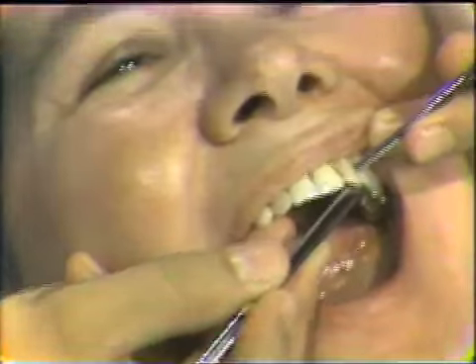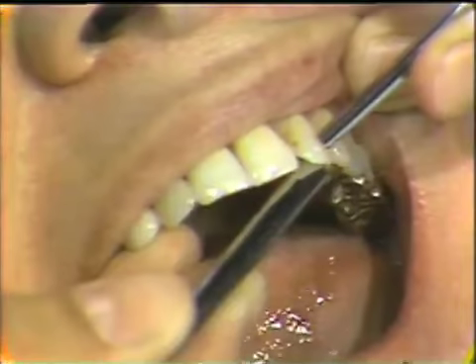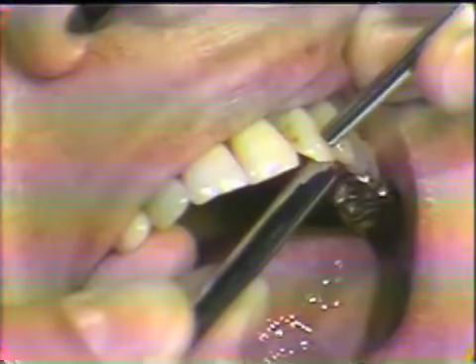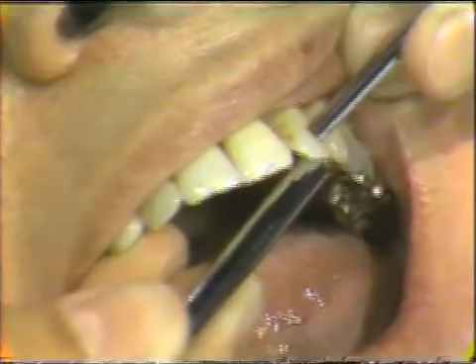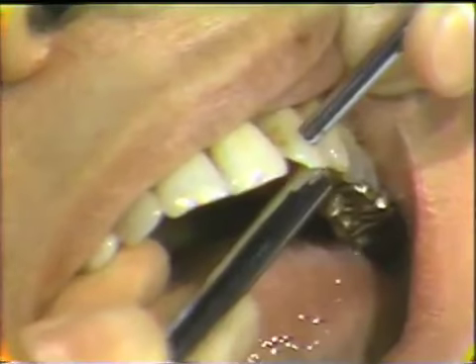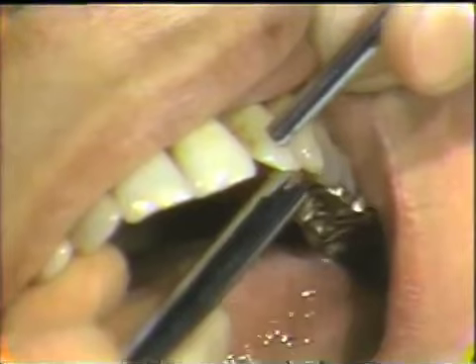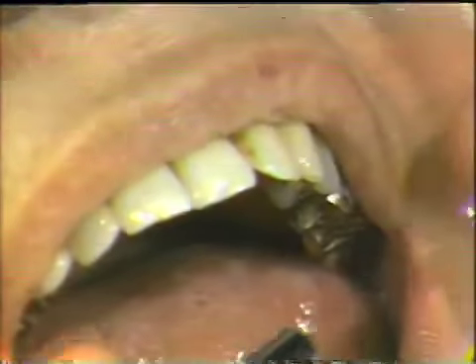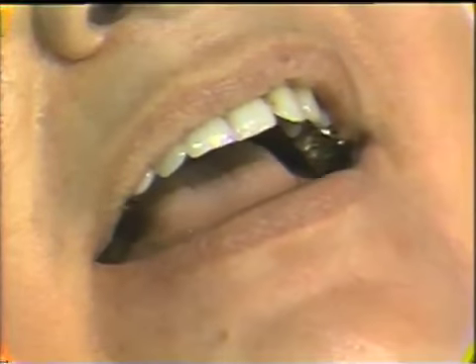I'm choosing this anterior tooth. You should put two hard instruments on the tooth. If you use your fingertips, they will absorb the movement. Now, I'm going to move this tooth back and forth. You can see the tooth moving. That has a greater than normal mobility. All of the teeth in both arches should be tested in this way, particularly the abutment teeth.